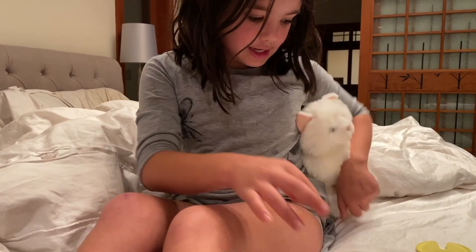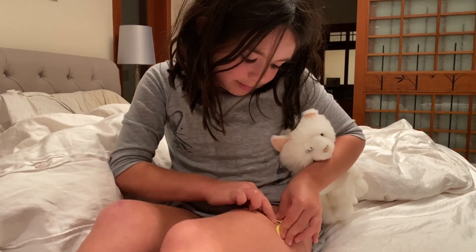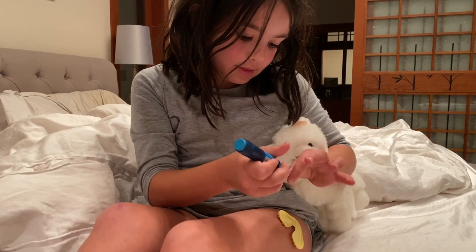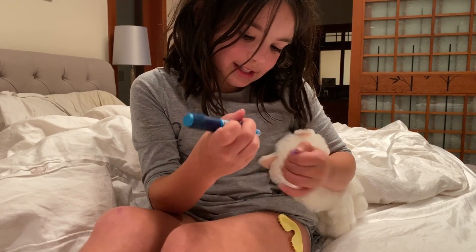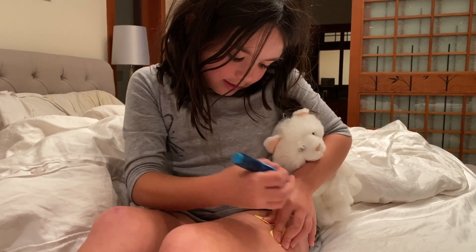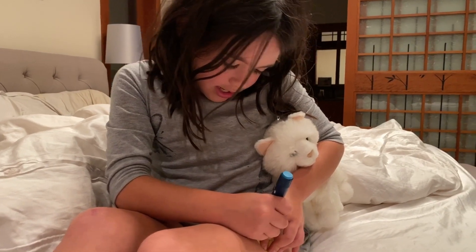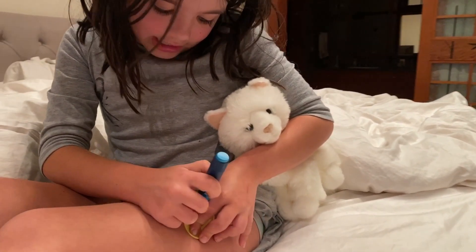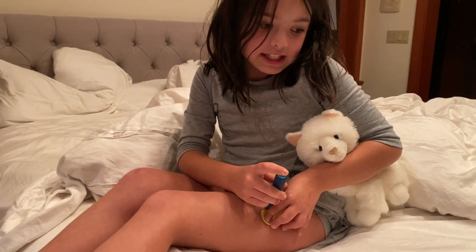Down there. Now here — if you have one of these awesome things, then press it in tight. Before you do that, you've got to take off the caps. Be careful when you take off the second cap — I don't want you getting stabbed. Now you press it in as tight as you can and gently slide the needle in. Doesn't even hurt.